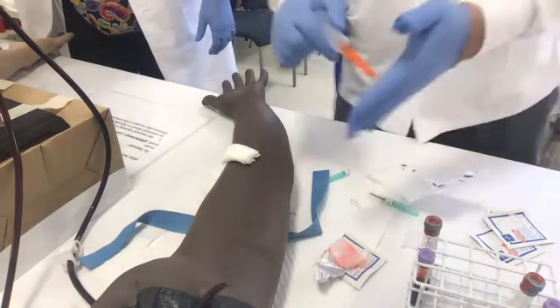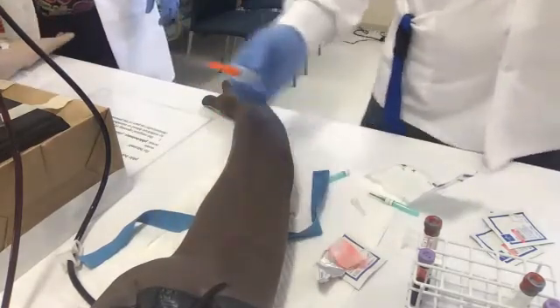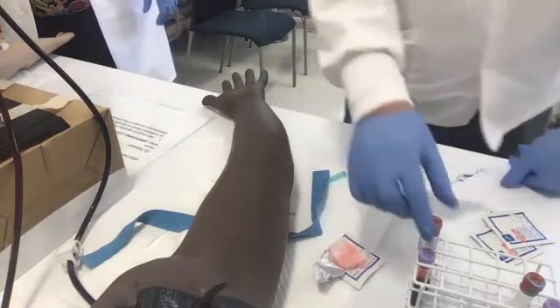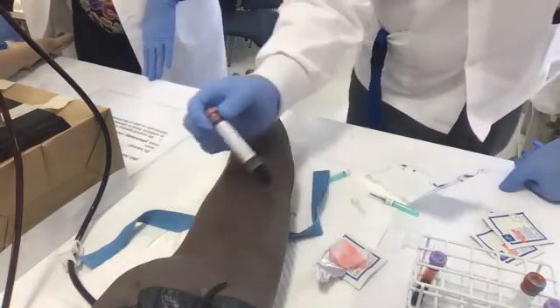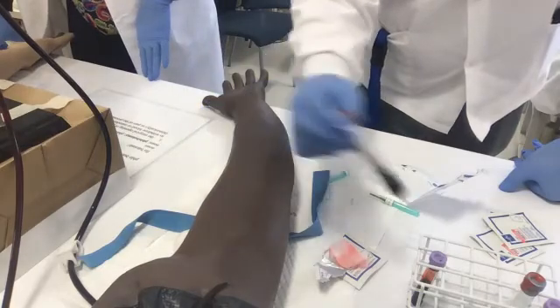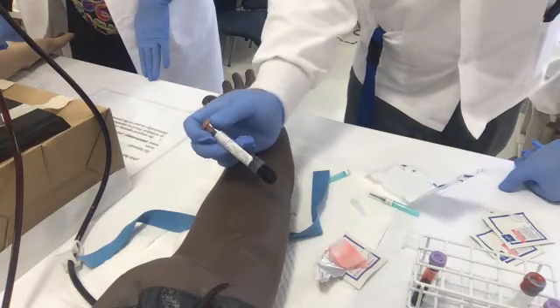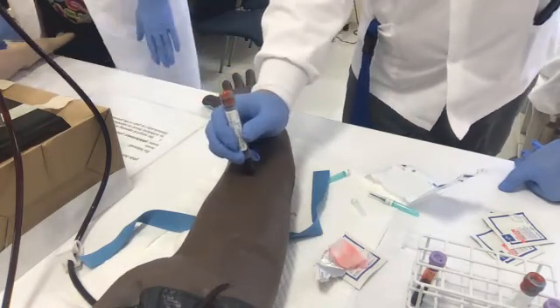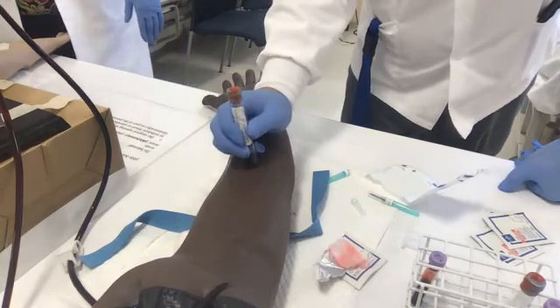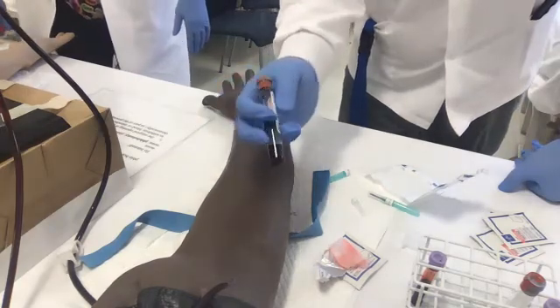Now you see? Can't hurt anybody anymore. Then I have to do what? Get rid of it. Now, this stuff is blood. You have to treat this like it's your life, because it is your life. And also, we have to treat it like it's what? Toxic waste. Because remember, universal precaution states that everybody in the room has HIV. Everybody in the room has hepatitis. And I'd be more worried about hepatitis than HIV, right?